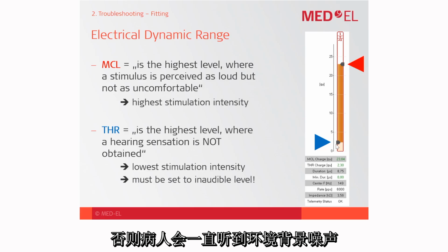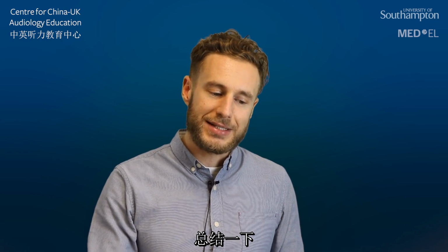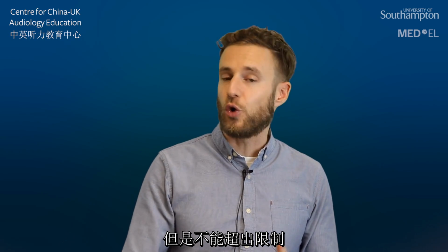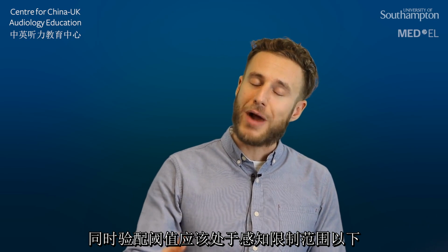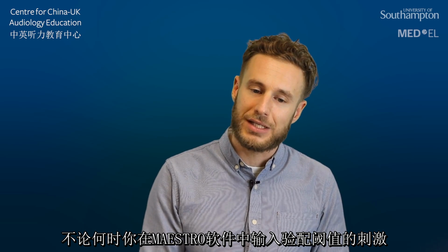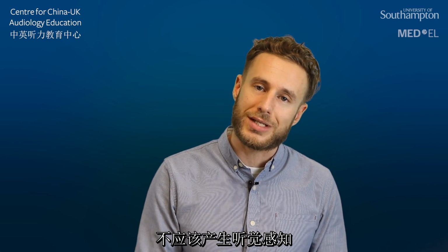Otherwise the patient could be confronted with artificial background noise. So again, to summarize, the MCL must be very loud and strong, but should not cause overstimulation for sure, whereas the threshold should be right below the detection limit. Whenever we apply stimulation at threshold level in the Maestro fitting software, there must not be any auditory sensation.